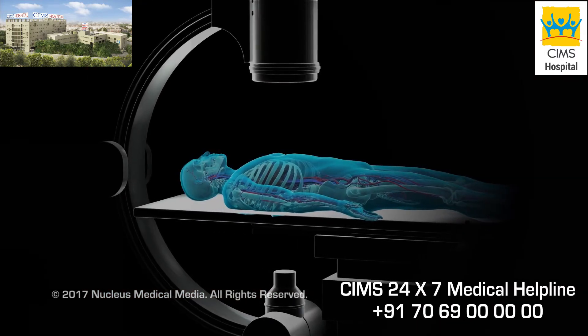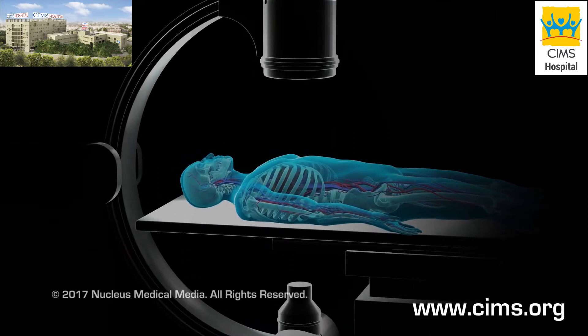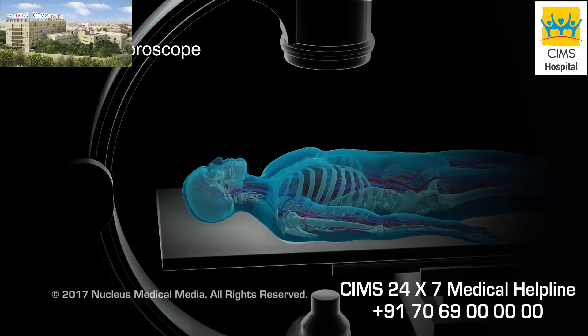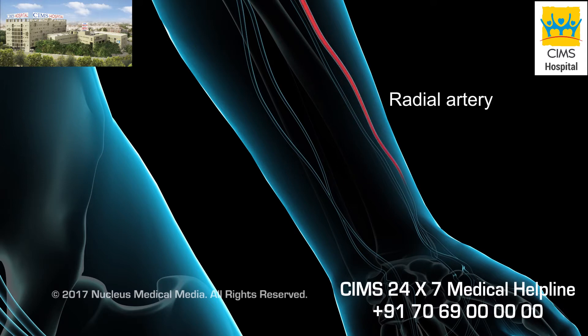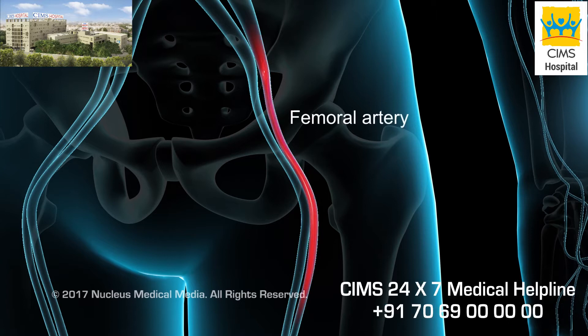Coronary angiography is often done with a medical procedure called cardiac catheterization. Before the procedure, you will be placed on a table with an x-ray device, called a fluoroscope. Usually, cardiac catheterization takes place through the radial artery in your wrist. This route normally has less bleeding and complications. Sometimes the femoral artery in your groin may be used instead.